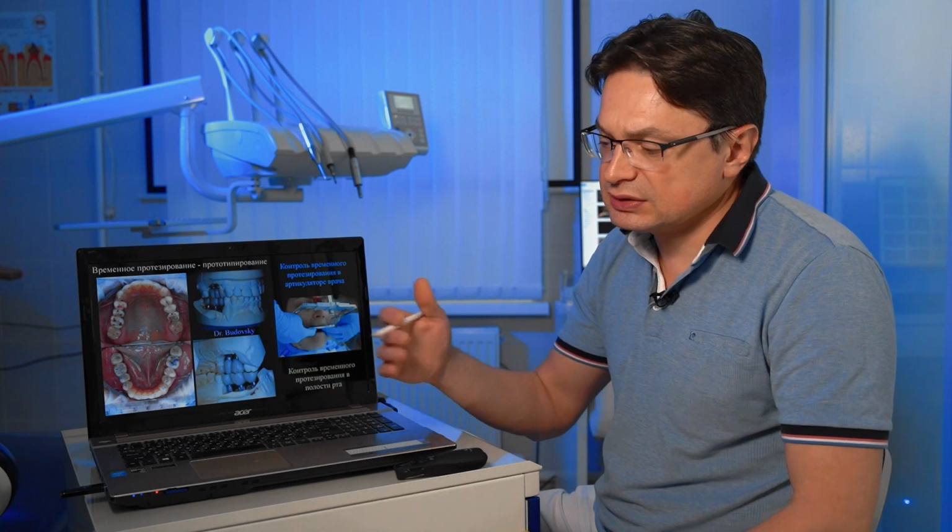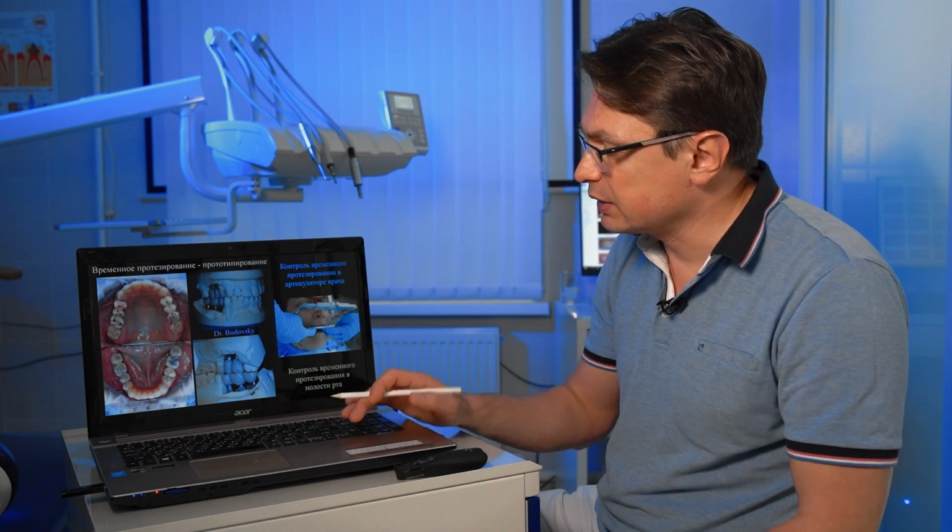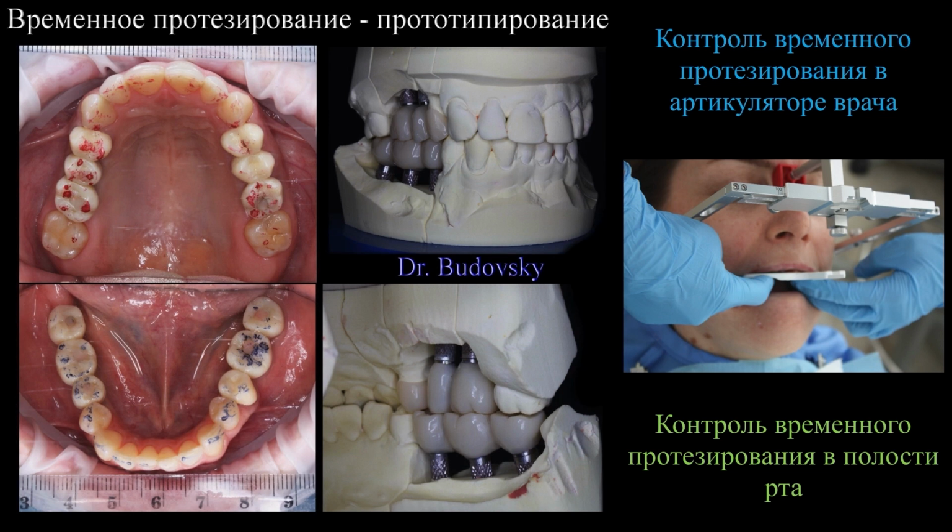I think we'll make a special video dedicated to this issue. How to set up, how to register, how to cast and why, and other technical questions so that you can check and control. Otherwise, if a technician does all this for you, then the technician will treat your patient for you, and this is fundamentally wrong.